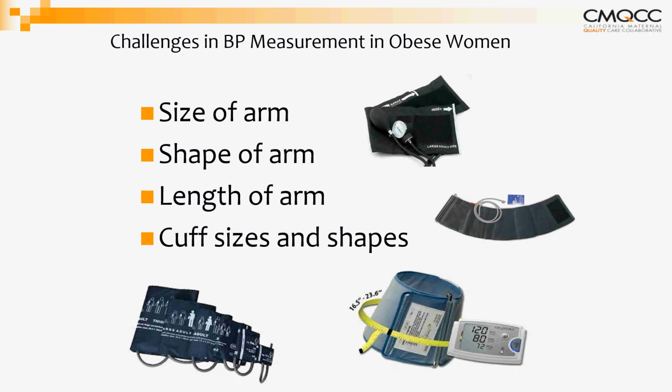So this is a point of consideration, and again, like I said, our population is getting bigger. We see more obese women, so it's important that when considering taking blood pressure in obese women, these are the things that we need to consider: the size of the arm, the shape of the arm, the length of the arm, cuff sizes and shapes. So the standard cuff that we may have on the unit may be inappropriate, and this is really important, and maybe something that many of us probably didn't have much education in when we were going through nursing school.